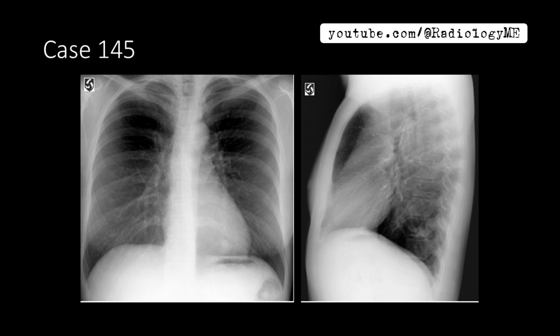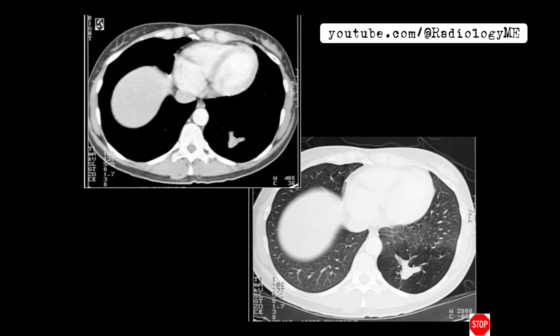We're presented with a well-expanded set of lungs, no pleural effusion, but there's something notable — a tortuous nodular opacity in the left lower lobe. Looking at the CT, we see a tubular branching opacity in the same area, the left lower lobe, with no identifiable connection to adjacent vascular structures or extension to the hilum. This is a mass-like appearance surrounded by an area of extensive hyperlucent lung parenchyma.